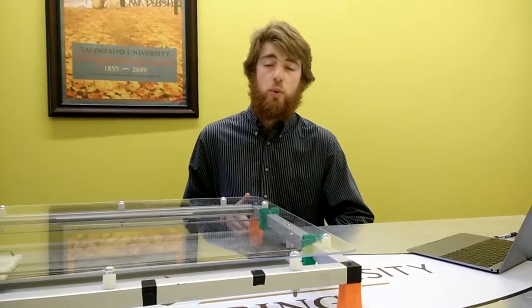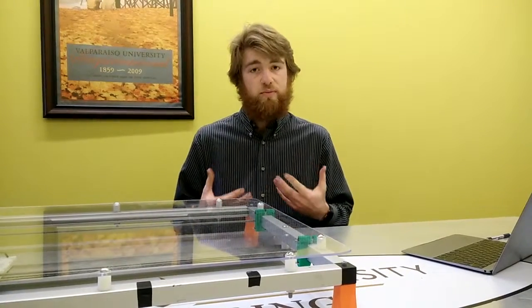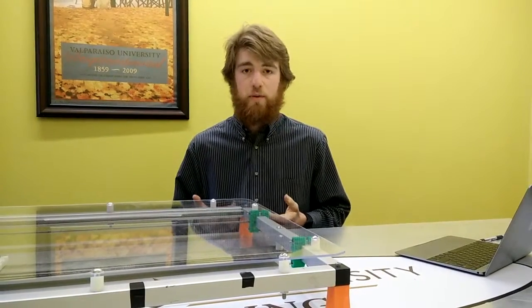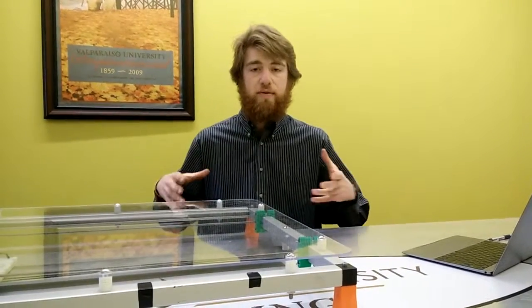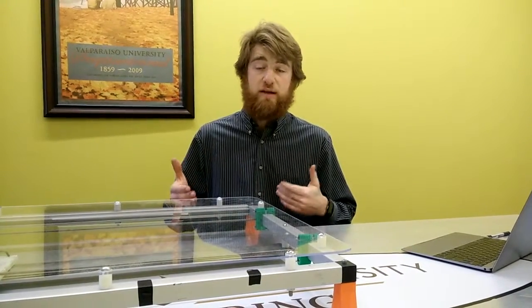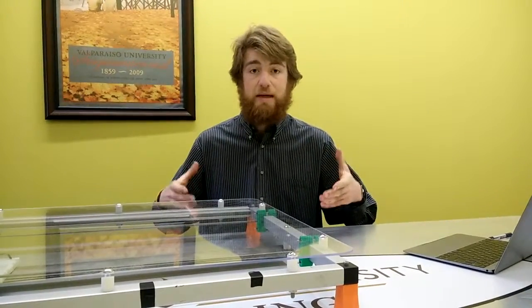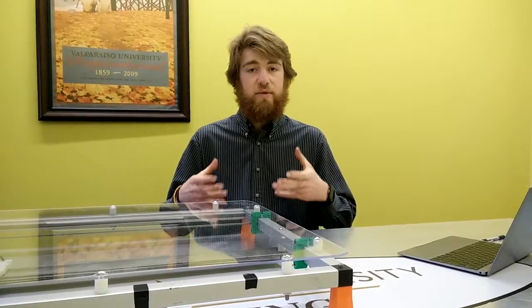In order to do this, we had a couple different approaches. One was to put some sort of suit or blanket on the infant that would have numerous sensors on it in order to measure light energy at a bunch of different points. The second one was to figure out the amount of light energy coming from the lights overall, and then where the infant is relative to the lights, and deduce the light energy hitting the infant that way. The third way was to take a total light reading of the area where the infant was lying in the crib, and then subtract the amount of energy hitting the infant from that.